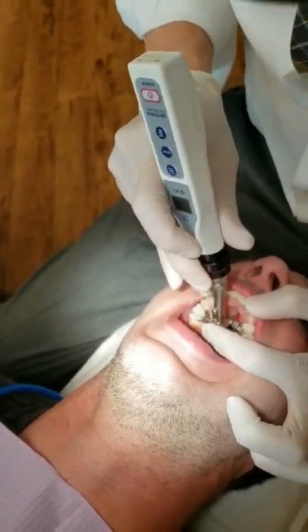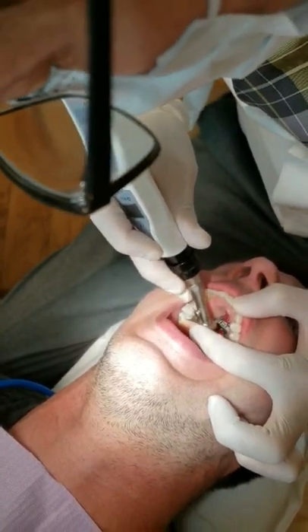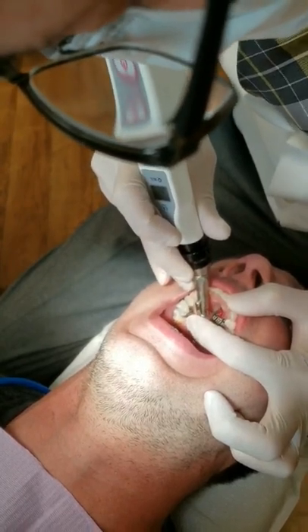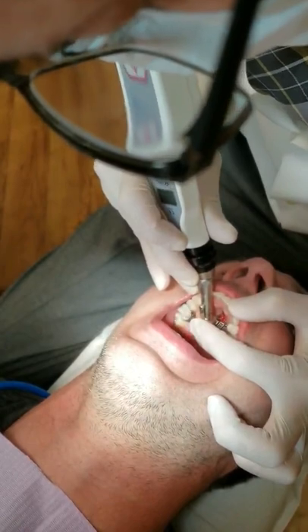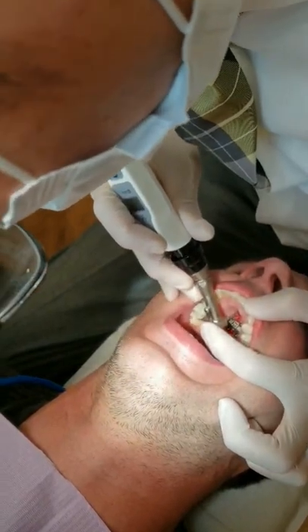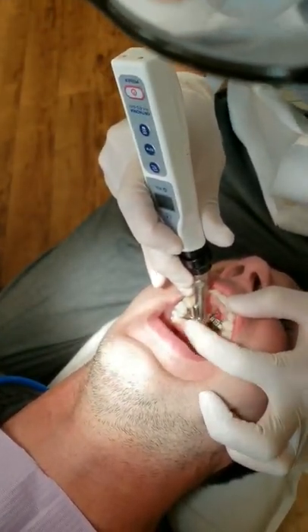Sometimes I explain to patients that there will be a little minor bleeding, but the bleeding should stop as soon as they leave the office. Bleeding stops pretty easily.